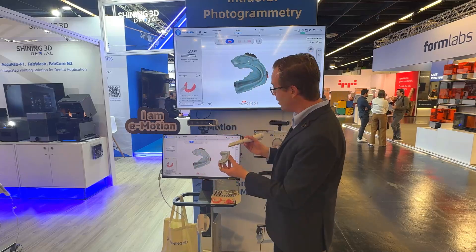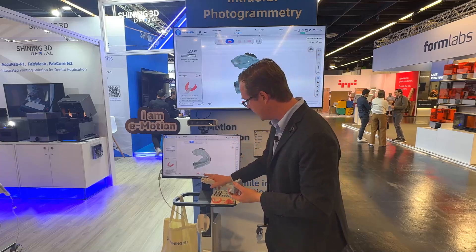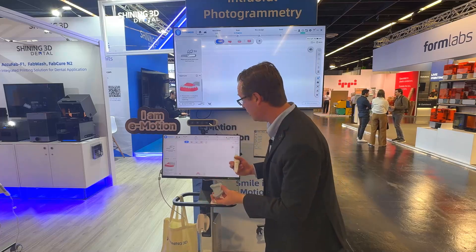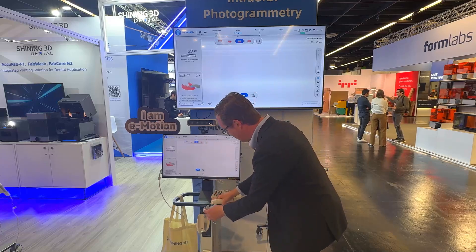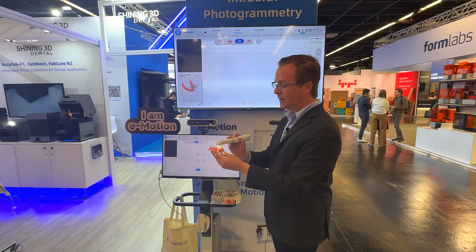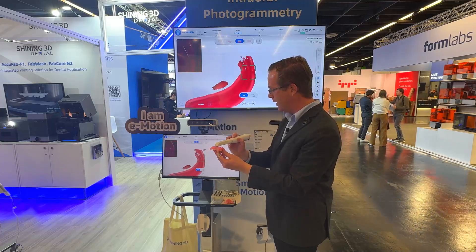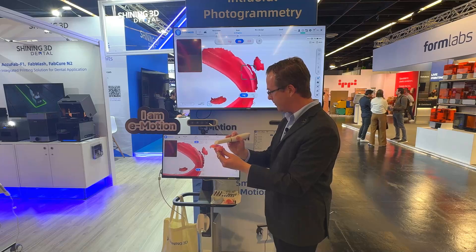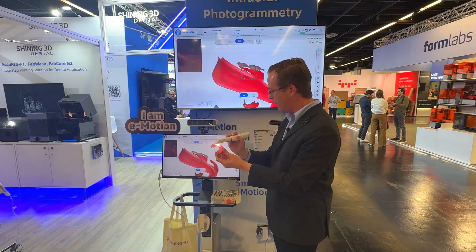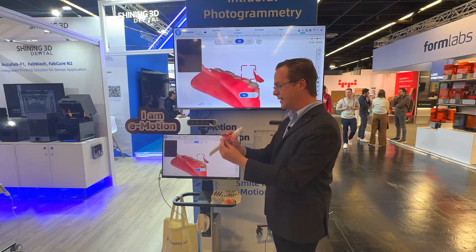In just a matter of a few seconds it allows me to very easily scan this and make it workable. As I was scanning, it was pretty simple, and now here's the secret: I click the checkbox and check button, then I can translate over to the denture — I click on the denture mode right here. I grab the patient's denture and start scanning, beginning on that retromolar pad area. As I'm scanning, the scanner joins these together, and I do a 360 scan of the denture, joining together all the details I need.